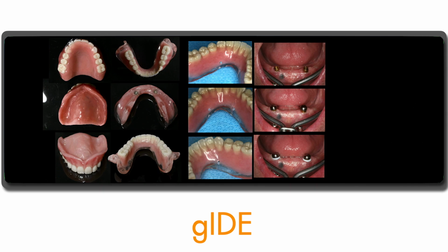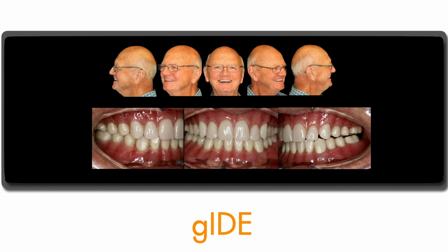So here what happens is we've made little vent holes in the prosthesis. You can see the little vent holes. We've mixed up acrylic and picked up these locator attachments inside the mouth, ensuring that we block out the undercuts. These little white rings are the blockout rings that block out the undercuts within the overdenture. And we pick these attachments up directly in the mouth. And then we hopefully have a happy patient at the end, with good occlusion.